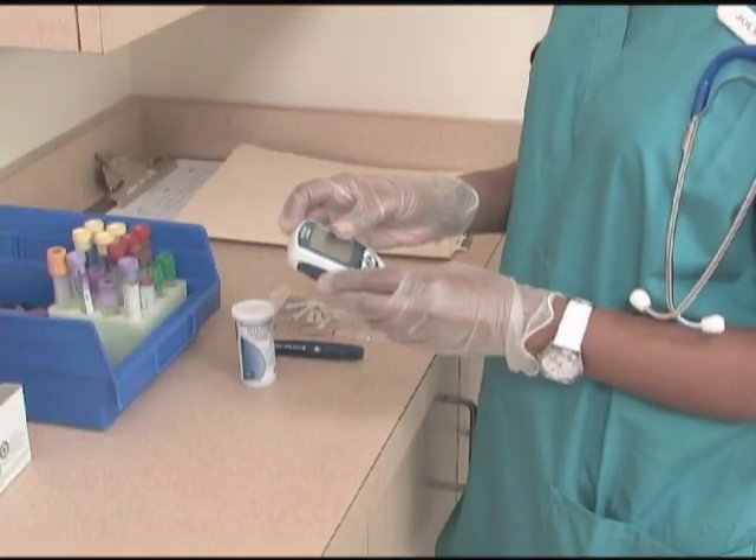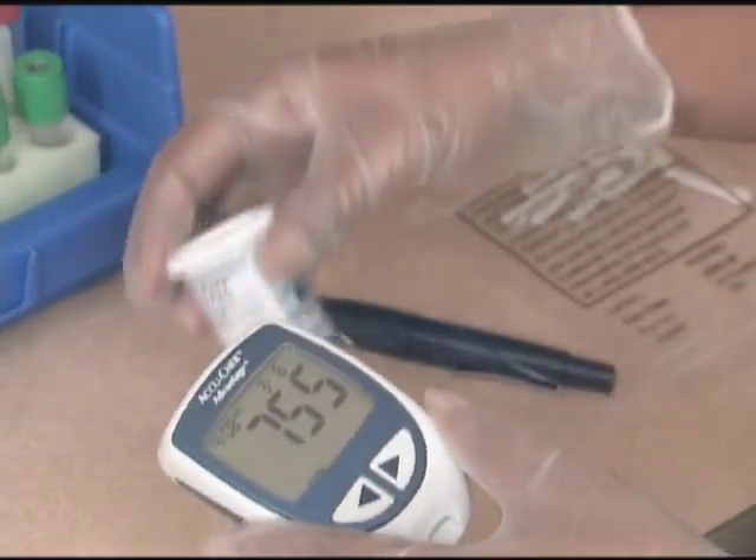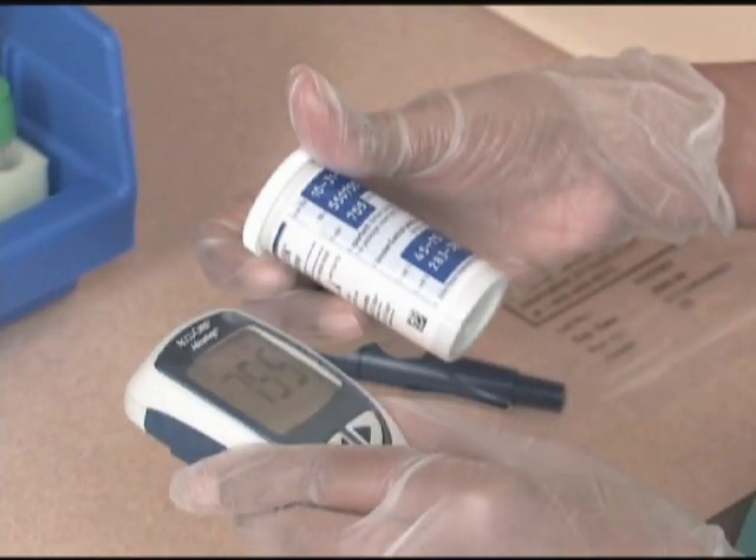Turn on the glucometer by pressing the ON button. Ensure the meter's three-digit test strip code matches the code on the test strip bottle. If not, enter the appropriate code.